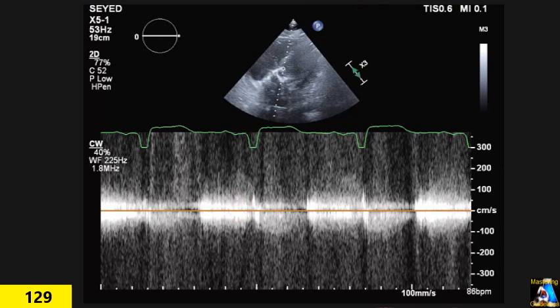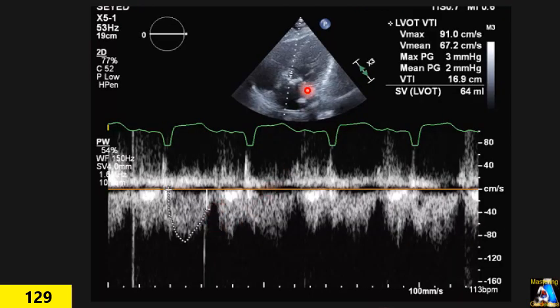I think we got this one, we do LVOT. The stroke volume is an acceptable measurement, but even though we are close, you can see the click on the valve. We are very close, but still at least we got some LVOT and stroke volume measurement. The LVOT on this patient was, I think, 2.1 or 2.2.